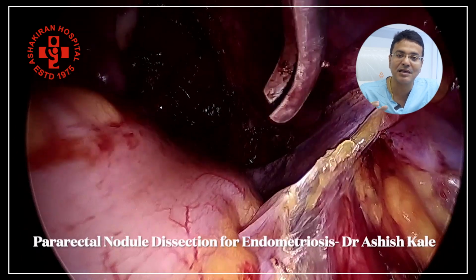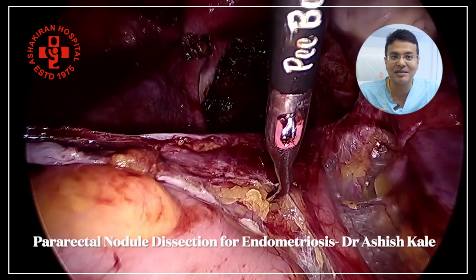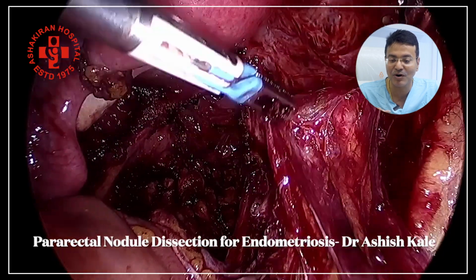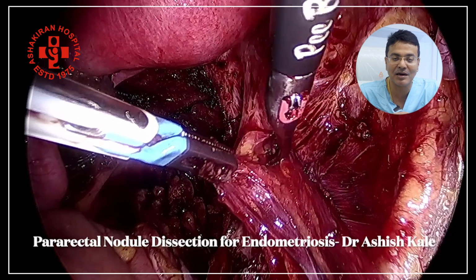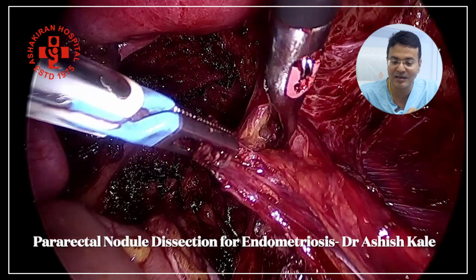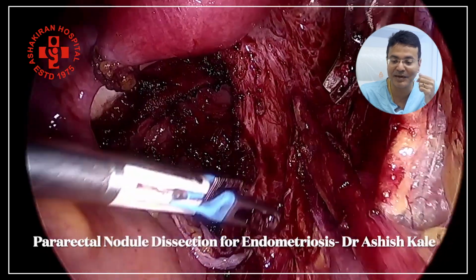The ureter is involved in this particular parametrium, and it is usually the disease affected by endometriosis. You can see we are just doing blunt dissections between the two folds of the periureteric sheath. You can observe here the periureteral sheath is adherent to the ureter, and so this blunt dissection helps a lot. You can see the ureter is now lateralized and we are just giving strokes parallel to the ureter, and the ureteric sheath is dissected.